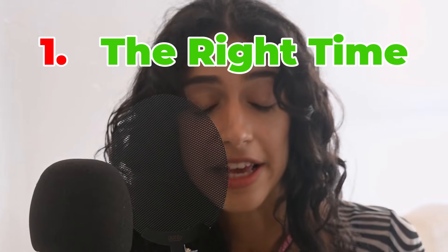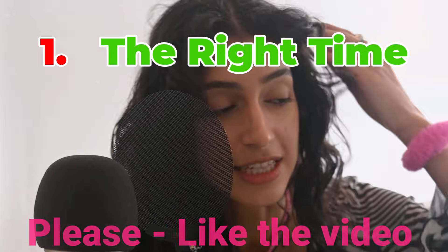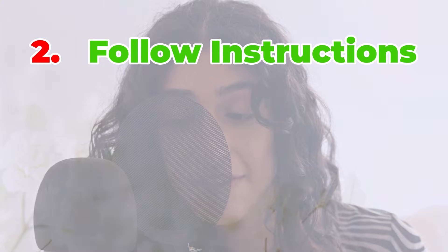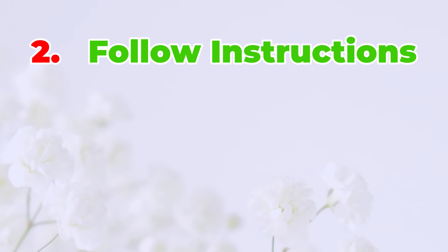Choose the right time. Wait until after your period is late to take the test. If you test too early, the signal might not be strong enough and you could get a wrong answer. Most tests work best one week after your missed period. Follow the instructions — every test comes with instructions, so read them carefully. Some tests ask you to dip a stick into a cup of pee, while others want you to hold the stick under your stream of pee. Make sure you do exactly what the box says.